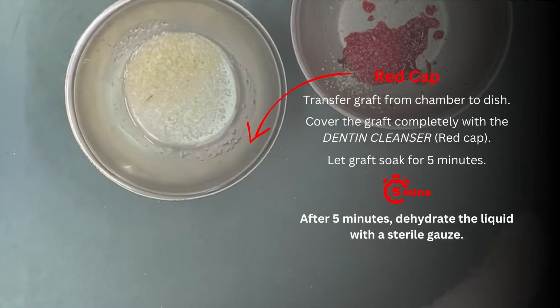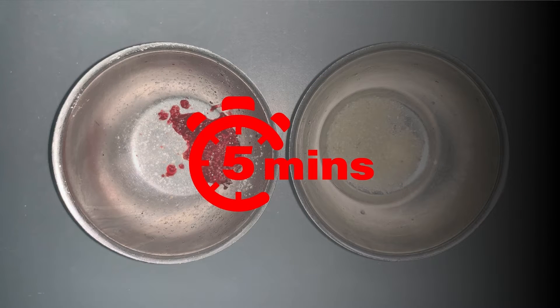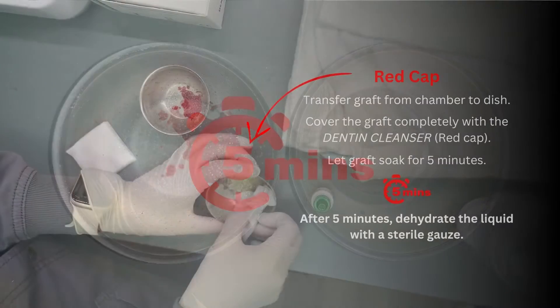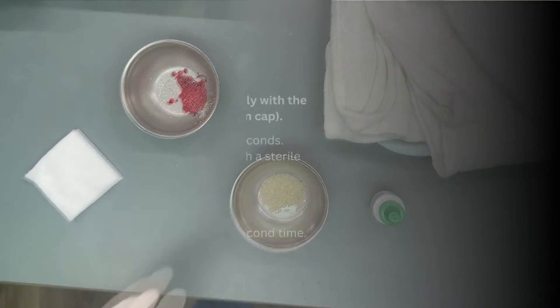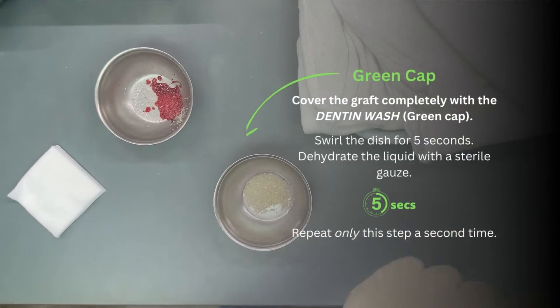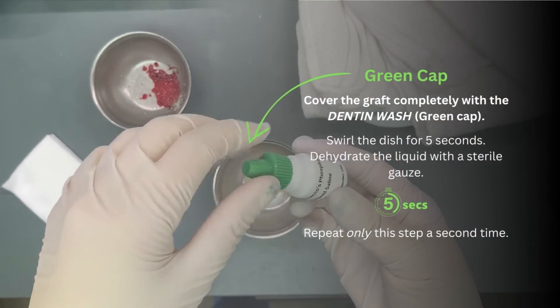I already used the red. We already dehydrated that and now we have to go cover the graft completely with dentine wash.